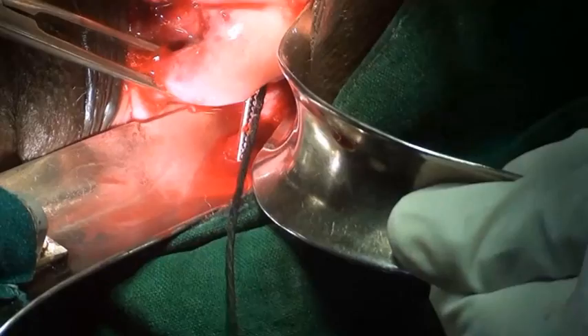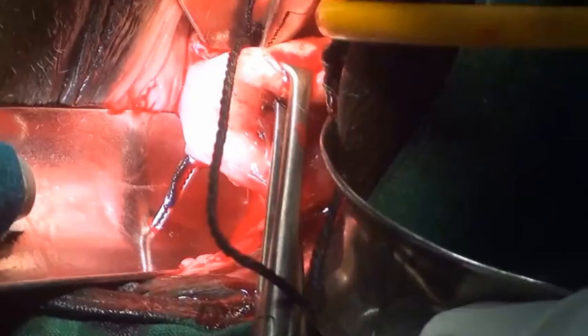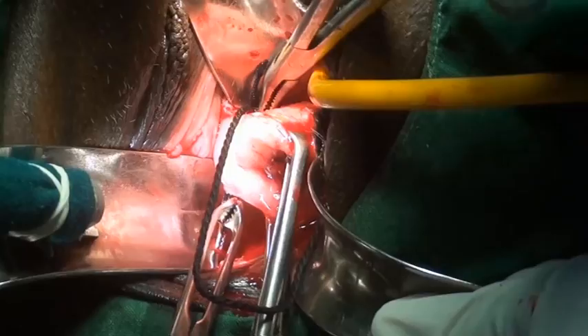The same procedure is repeated on the opposite side with the other end of the thread. The suture is placed very close to the cervix. The threads are pulled down together and then tied tightly and as high as possible.